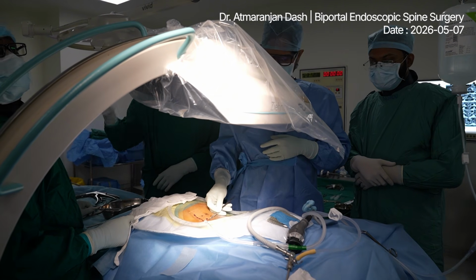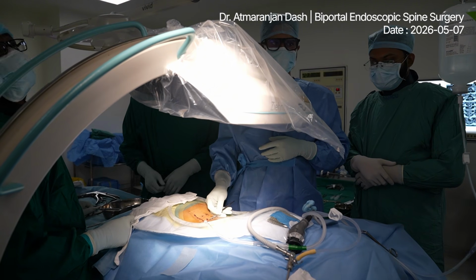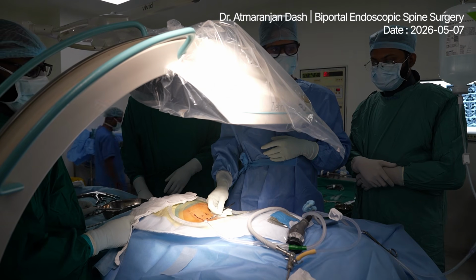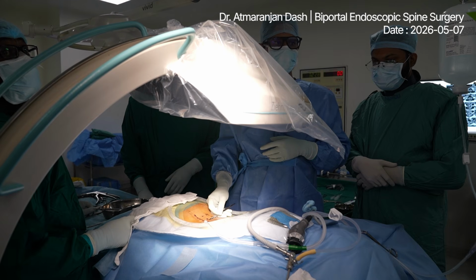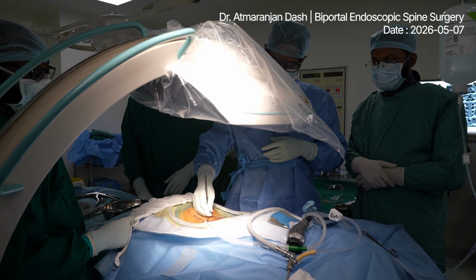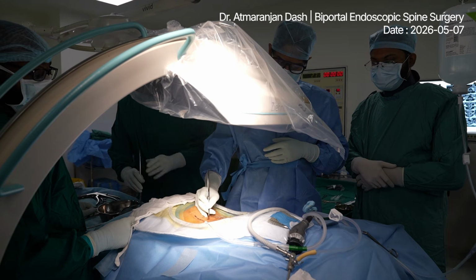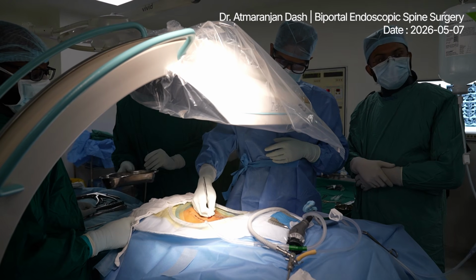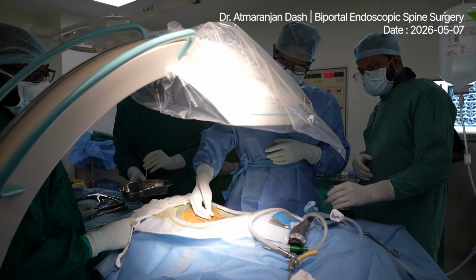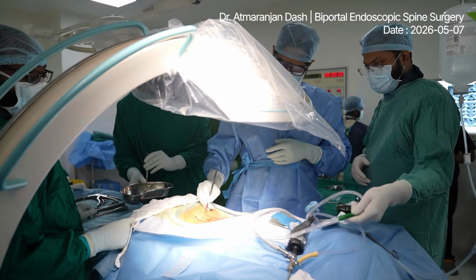Now we are going to do a para UBE on the affected side. Both levels, L4-5 and L5-S1, we are going to operate. I will share the scans with you. Take a shoot. How do we do para UBE? This is what I do. I land directly on the TP, TP landing para UBE, which is one of the very predictable ways of doing it. But you should learn how to do it so that you can do the surgery faster.